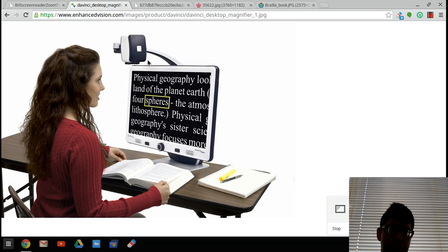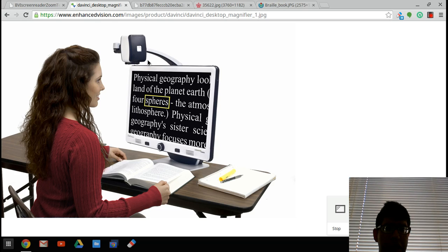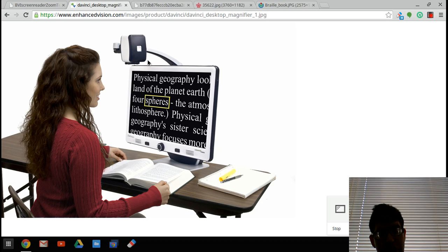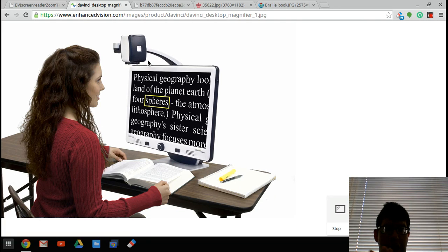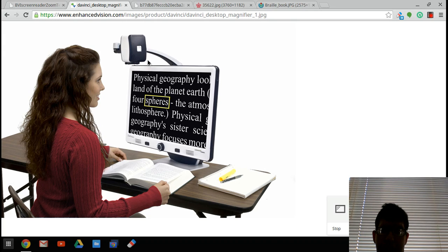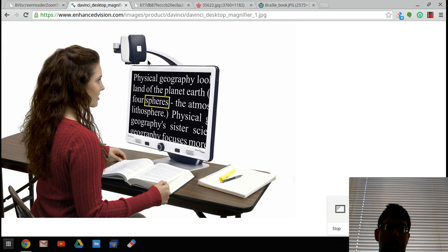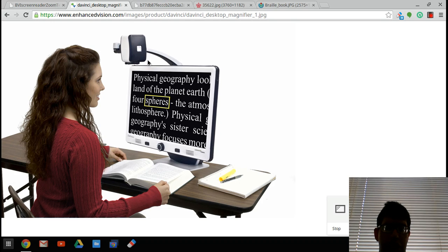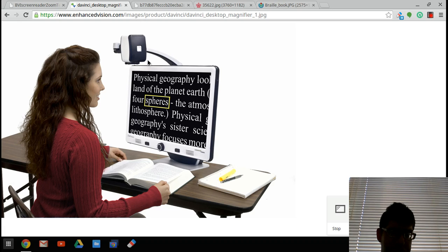As a result, rather than enlarging the text, having something like this device that allows you to enhance the text, but at the same time push a button and have regular print, it would still be enlarged, but you would have things like diagrams, maps, pie charts, things that are meant to be seen the way everybody else sees them. And again, the way I see it, it helps to promote literacy and understanding of the materials.